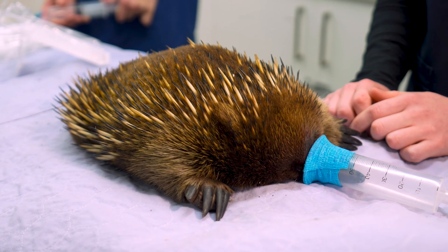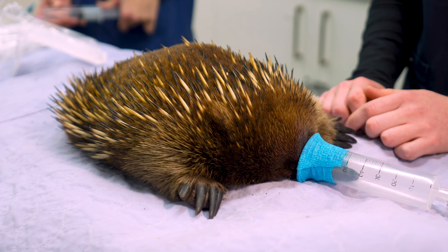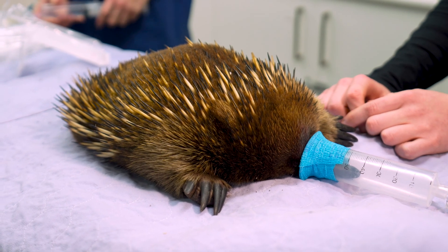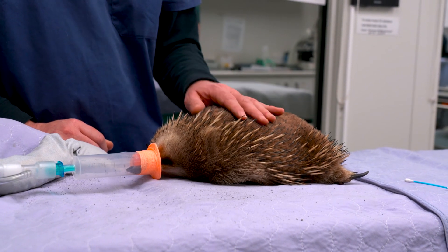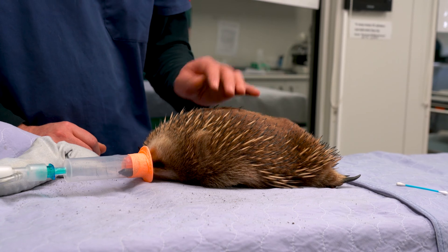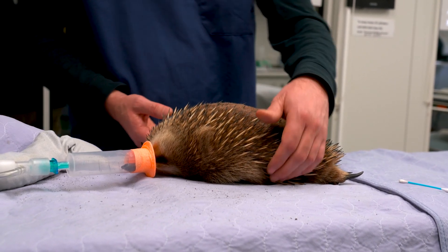We can make a mask for an echidna out of an old 60ml syringe. You cut off the hub so that it fits onto the anaesthetic tubes, and then you can make a makeshift mask on the other end with some vet wrap.